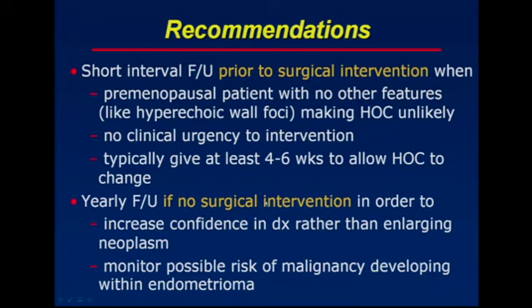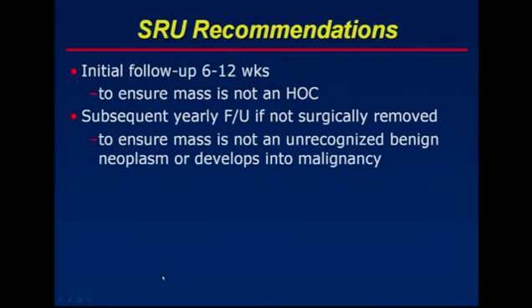And typically there's no clinical urgency to intervening, so wait a few weeks and get the follow-up sonogram in those cases. If the patient isn't going to have surgery because they're asymptomatic, and you suspect an endometrioma, a yearly follow-up is probably indicated because you'd like to increase your confidence in the diagnosis by showing that this is not increasing in size, and also monitor for that small but definite risk of malignancy developing within the endometrioma.